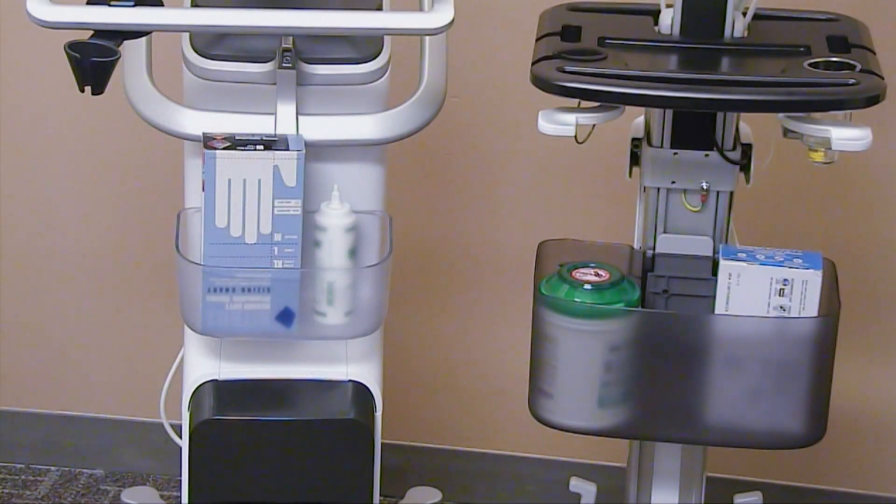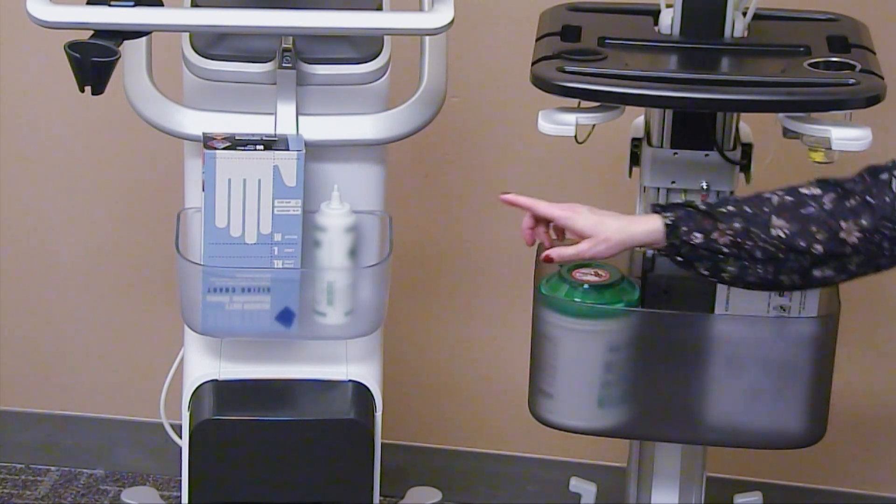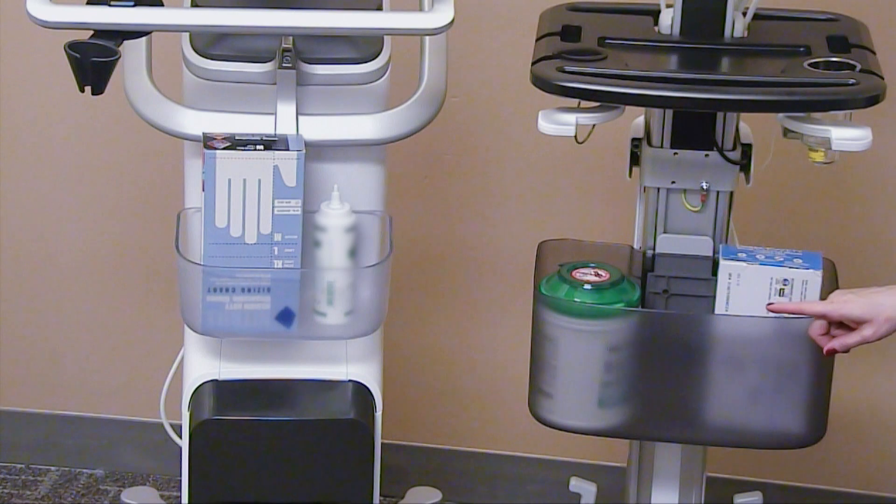Each system comes with a storage bin. On the Venue, you have an option for a large or small size, while the VenueGo offers a large standard size. Additional accessories include an ECG module, black and white printer, and barcode reader.